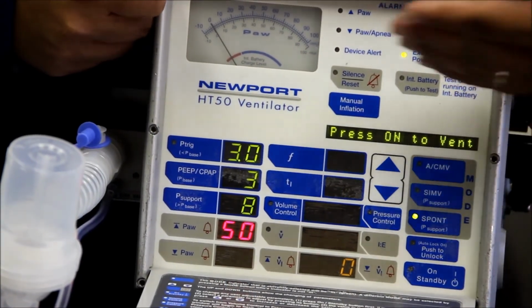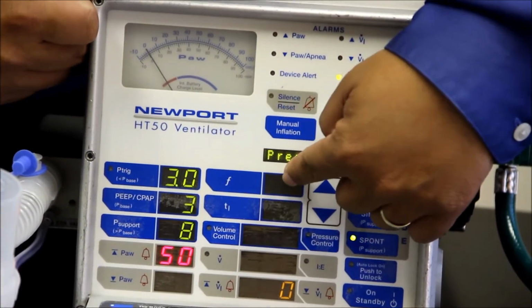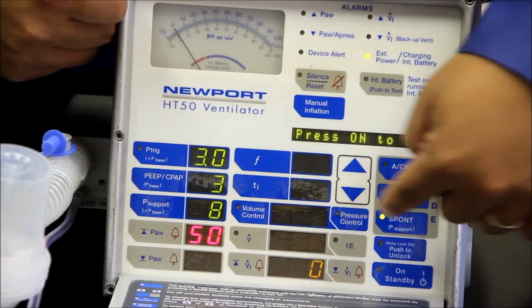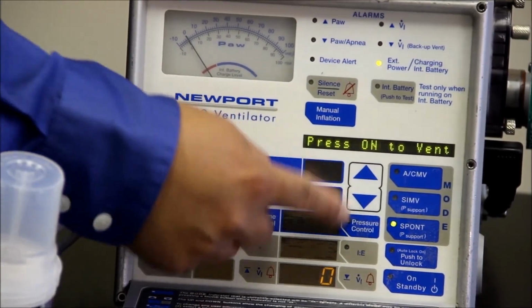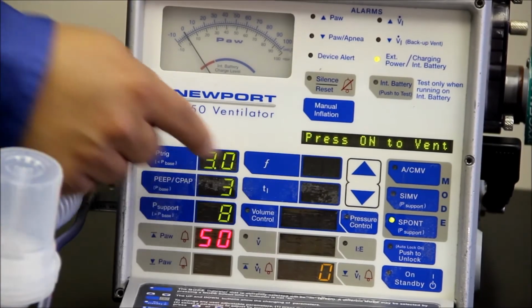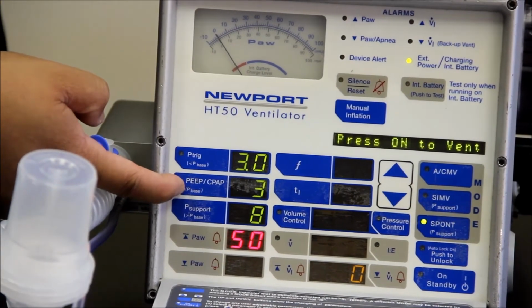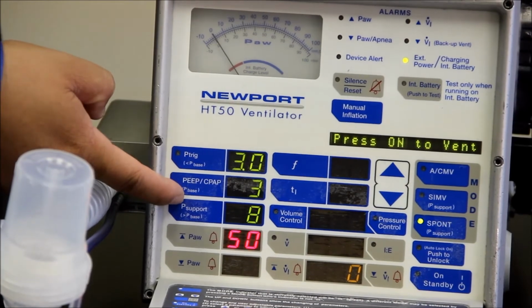Once I press that, you'll see all these functions here: the volume control, the tidal volume, the frequency, and the inspiratory time. They all disappear. The reason being that when a patient is breathing on their own, the ventilator is not breathing for them at all. So it takes away all that extra breathing that the ventilator will do. But you'll see the things that remain are the PEEP and also the pressure support. The reason these two remain is that they help the patient breathe.